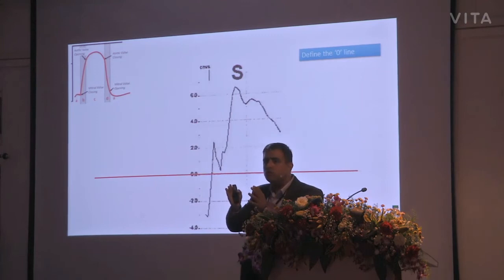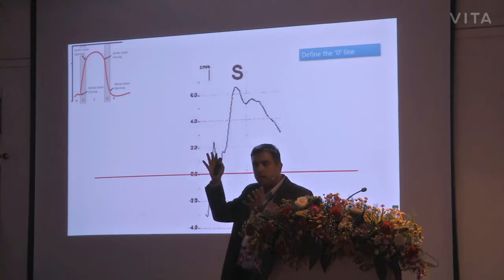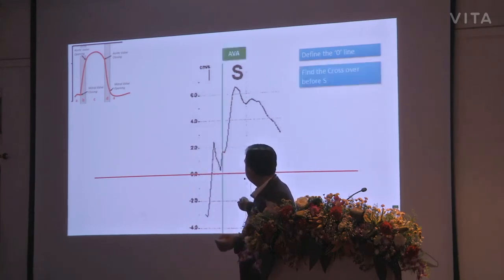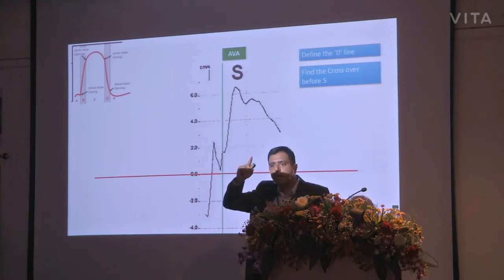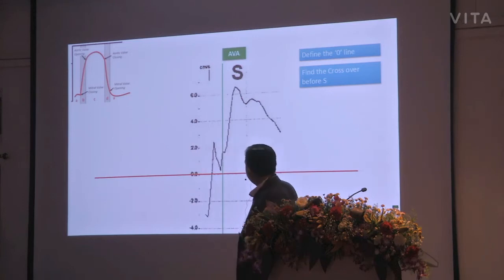a huge amount of movement of the base towards the apex. So the heart is contracting very rapidly from here, and you will know that this is where your aortic valve opens. Okay. So we know where the aortic valve opens. Now we need to know where the mitral valve closes. Okay. Now, if this is the aortic valve opening, what is this curve which you see here?